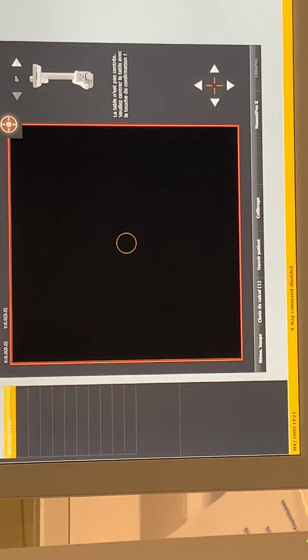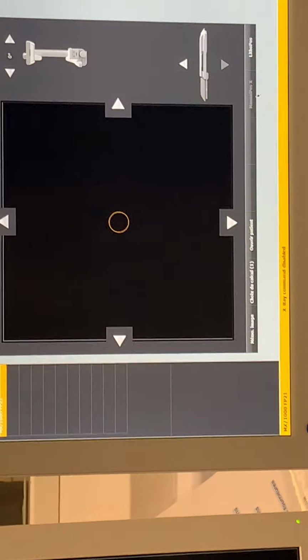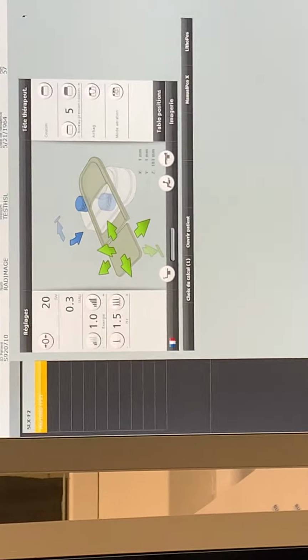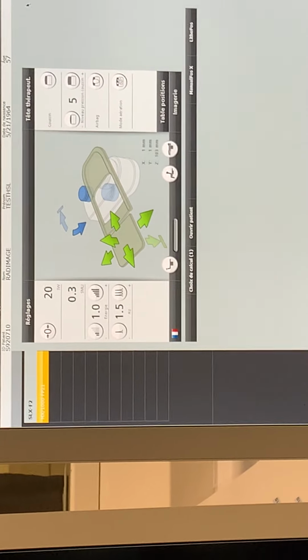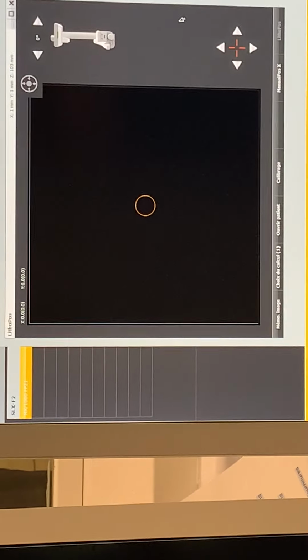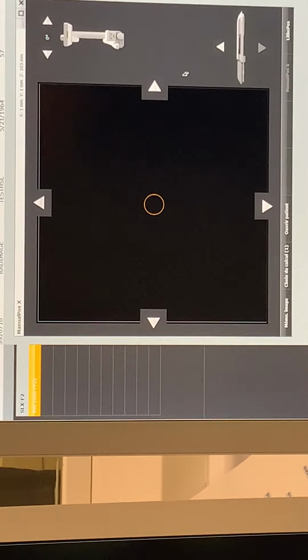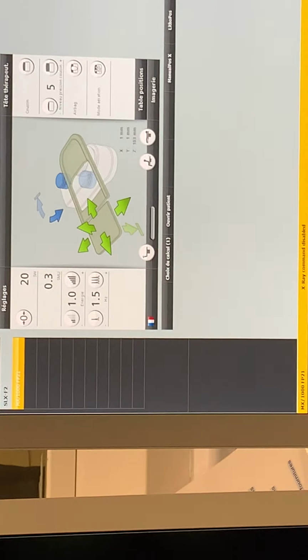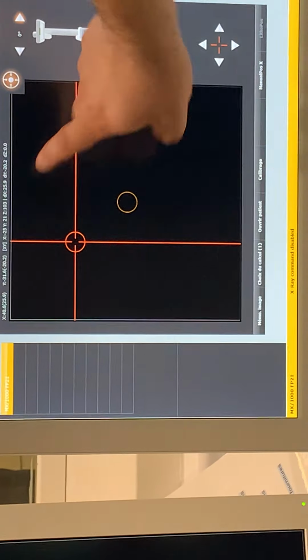For lithotripsy, we only need three short X-rays, and the stone is in the middle of the center. Will the machine find the stone, or do we find the stone? You will find the stone on the image. Press on the stone. Mark it like here, and it will go by the mark itself.